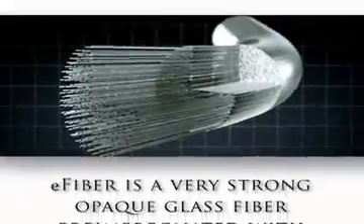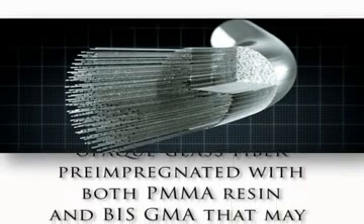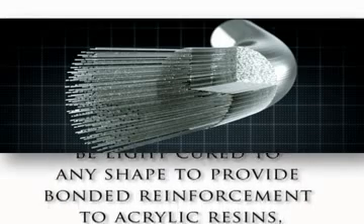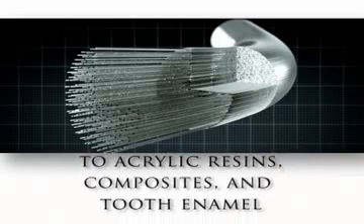E-Fiber is a very strong opaque glass fiber pre-impregnated with both PMMA resin and BIS-GMA that may be light cured to any shape to provide bonded reinforcement to acrylic resins, composites, and tooth enamel.